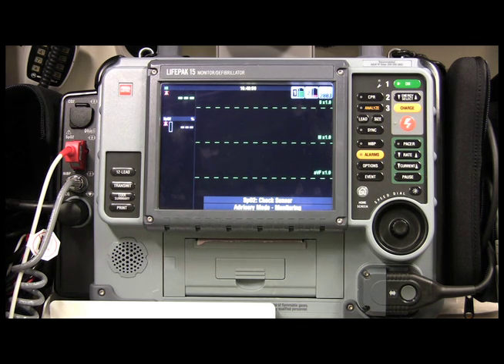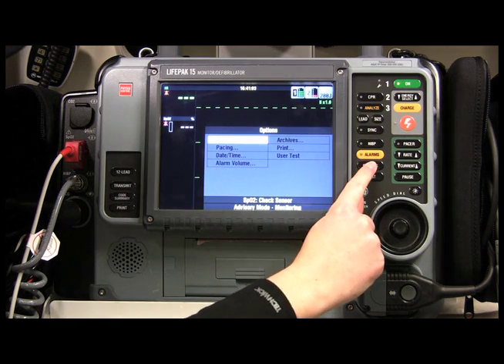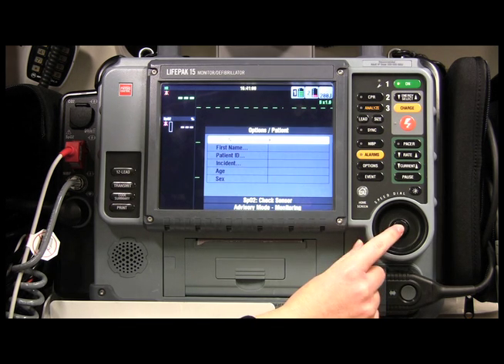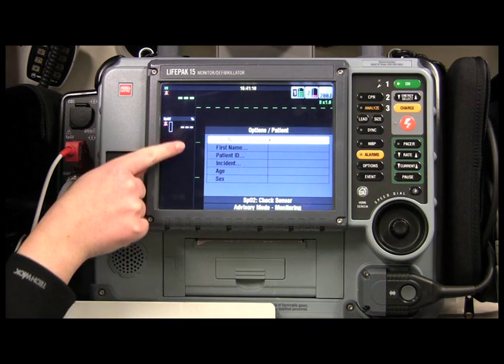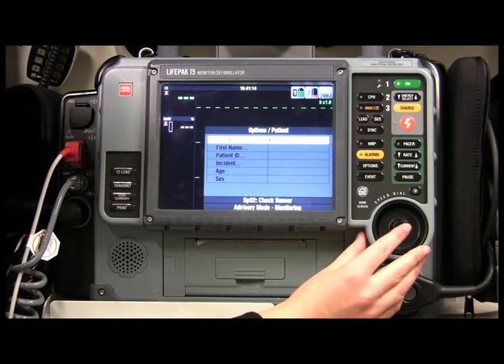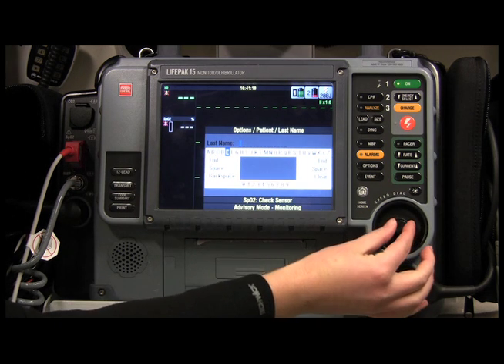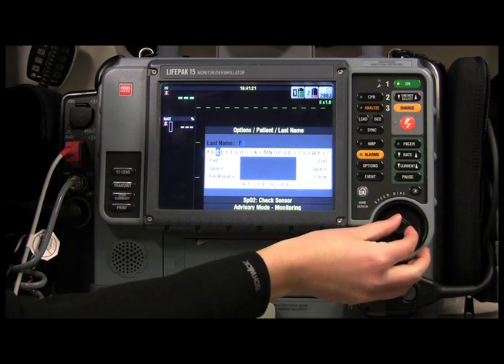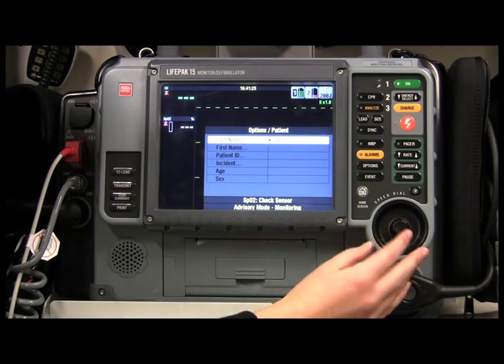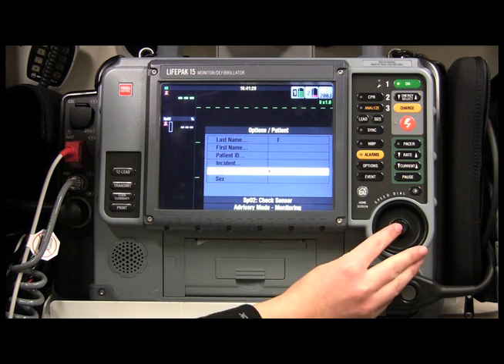Before we take any vitals, let's say we want to add some patient information. We're going to go to Options — Patient is already highlighted — so I'm going to click, and we have all these different things we can add patient data to. Let's go ahead and do last name; I'm only going to put in my first letter, but you can put in the full name and hit End.